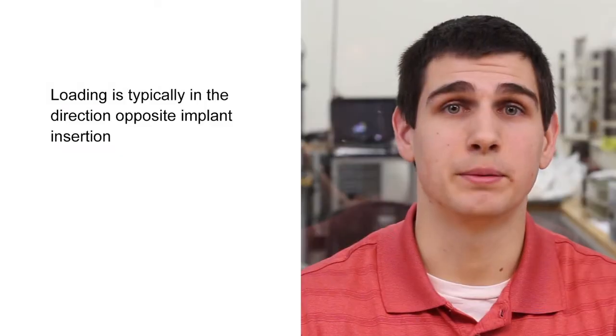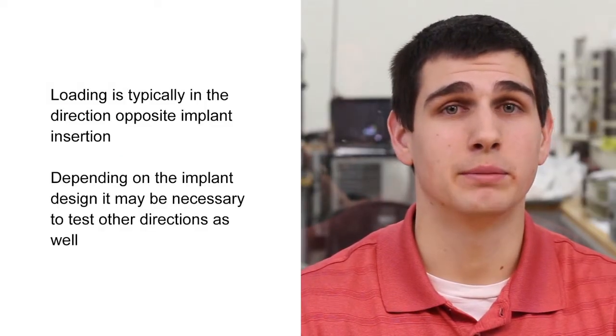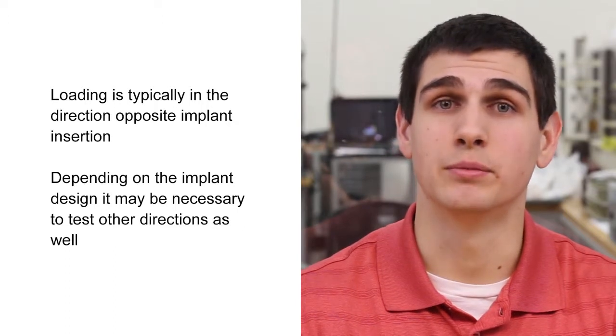Orientation is important, depending on the type of implant, to ensure physiological representation. Loading is typically in the direction opposite of insertion. However, depending on the implant's design, it may be necessary to test in multiple directions. That's a review of the 3 ASTM standards that are common when testing intervertebral body fusion devices.